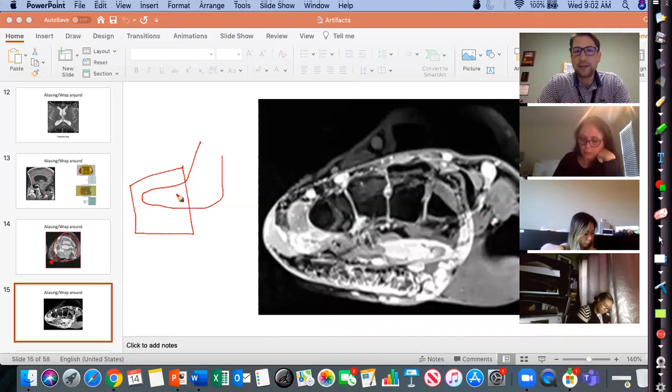But if you're just scanning the forefoot, like the toes back to the tarsal bones, if you don't turn on your oversampling, that heel might wrap into our image. So I can see here, since it's a taller structure, I'm pretty sure this is the heel. And then this area right here is that forefoot.